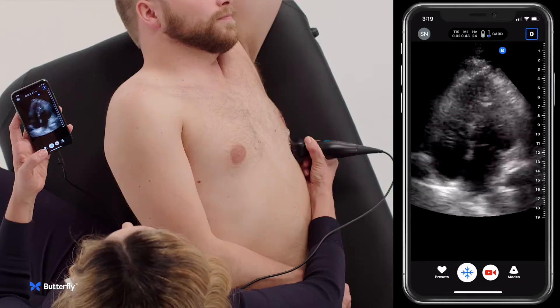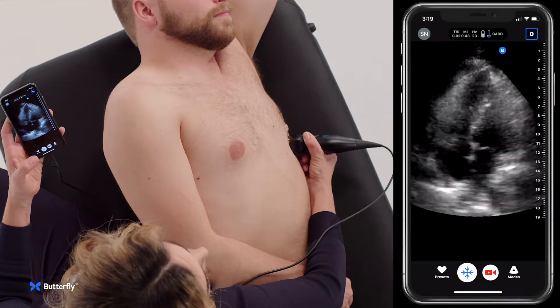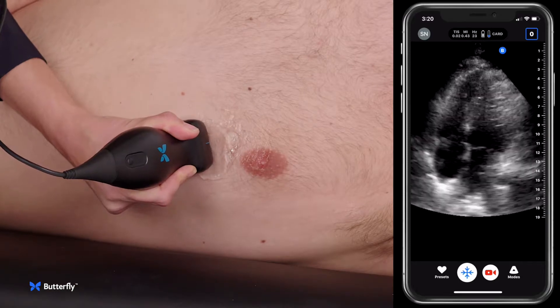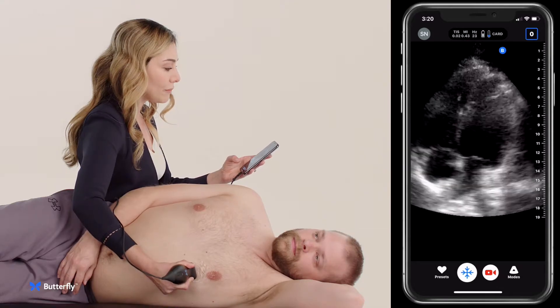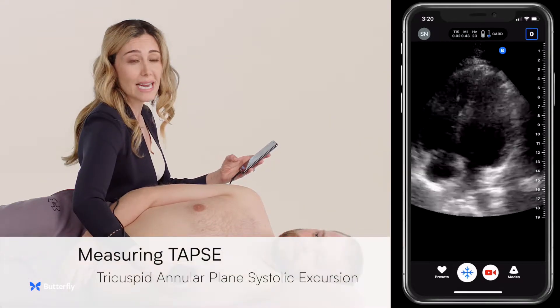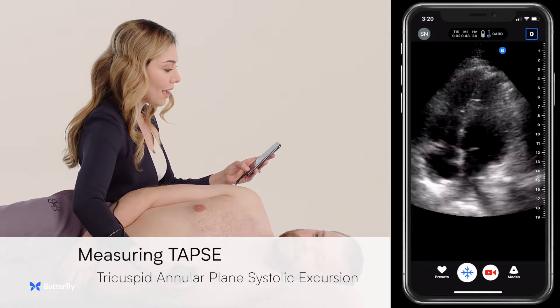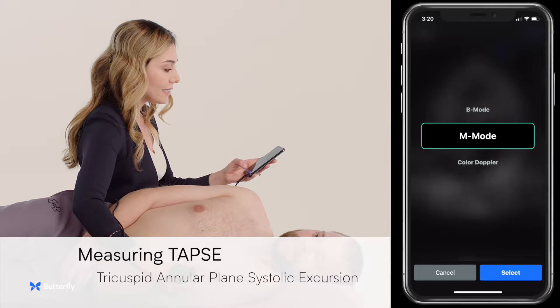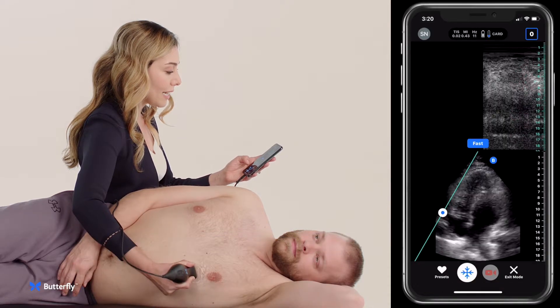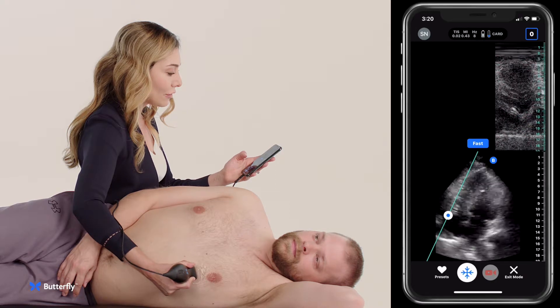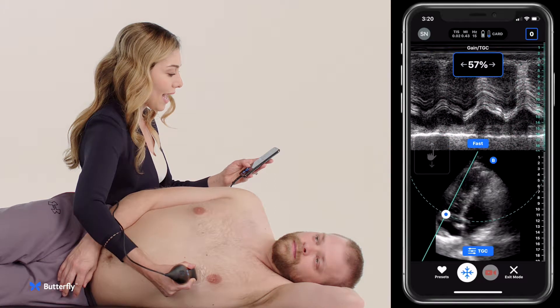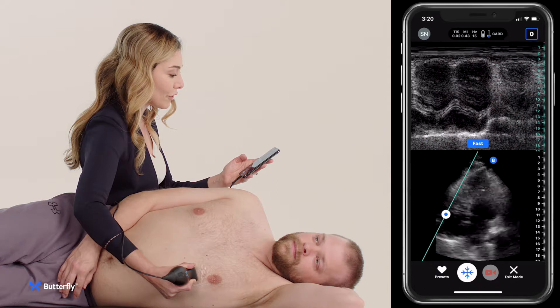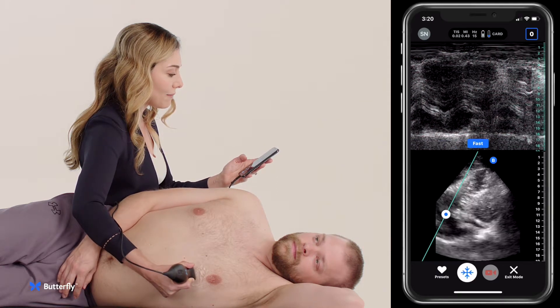Now sometimes this view can be challenging. It's helpful to turn the patient to the left side, as we did here — you can do that by sticking pillows underneath the right side. You really want to focus on that tricuspid annulus, the lateral portion, because we're looking for that vertical motion. It's called tricuspid annular plane systolic excursion, or TAPSE. You can evaluate the tricuspid annular systolic motion by selecting M-mode and placing it right on that tricuspid annulus, looking for the vertical motion.